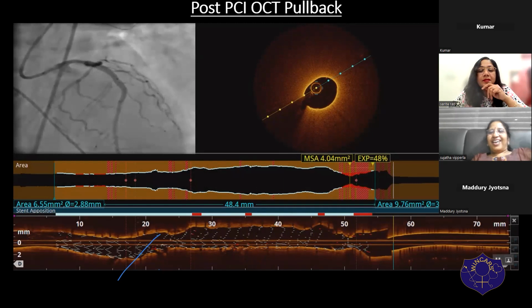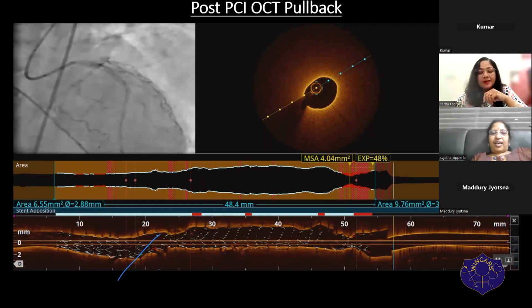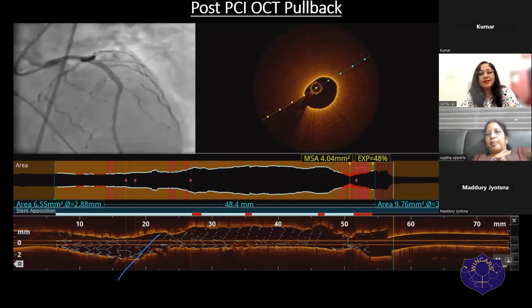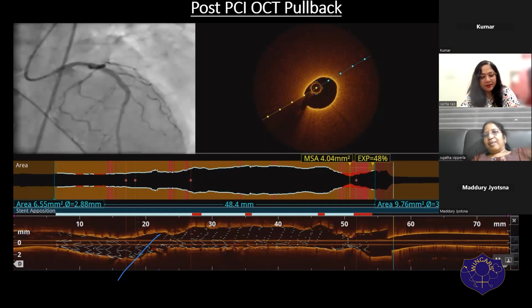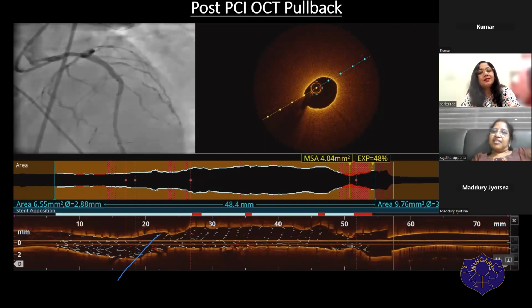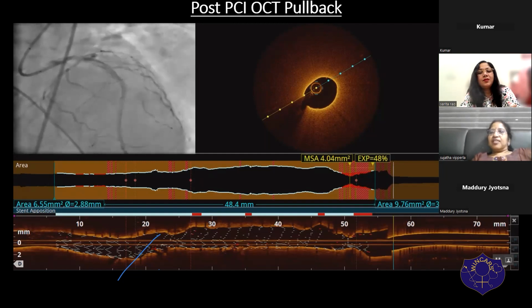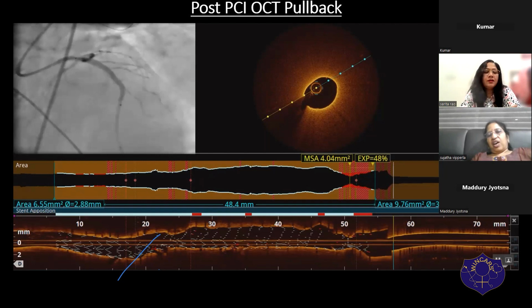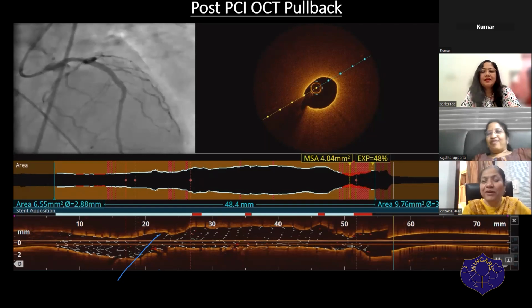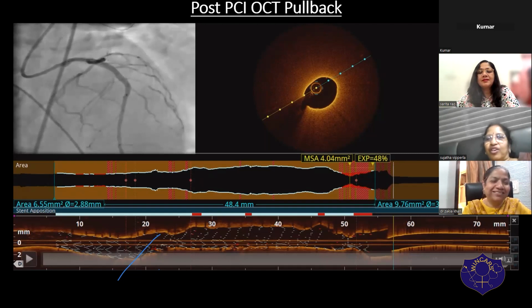Having an area of 4, I would say to the house, prepare before you put the stent. Prepare to the extent possible, go with your cutting, go with your OPN, go with all your gadgets before rather than after, instead of landing up in this situation of 4. I wholeheartedly agree with Sujata. Before, I'll do whatever it takes to keep doing things.